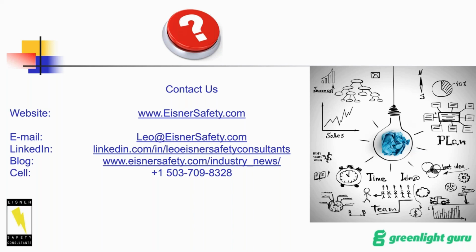So ongoing certification. Realize that the standards in every country have not transitioned to the new versions yet. So you're still testing to what everyone's been testing to. It's not an issue if you think about it. Everyone's still testing to 60601-1 Amendment 1. They're not testing to Amendment 2 yet because no one's requiring it regulatory wise. So it's not an issue. You have TRFs that exist for the existing version of the standard that everyone's been testing to.